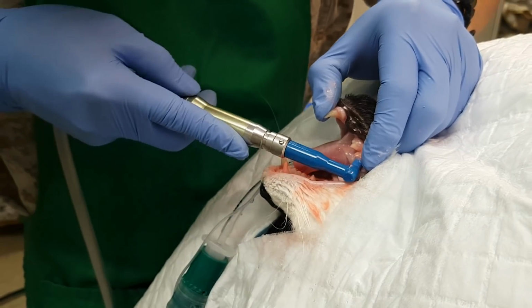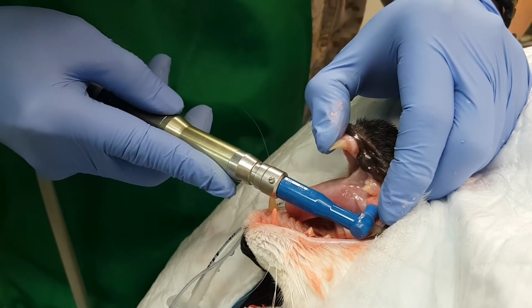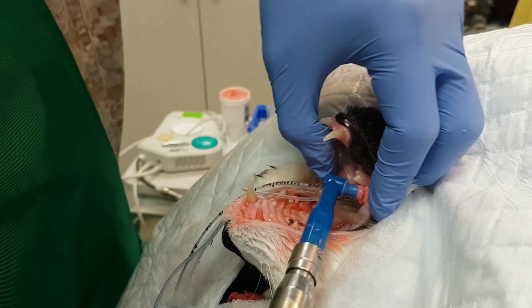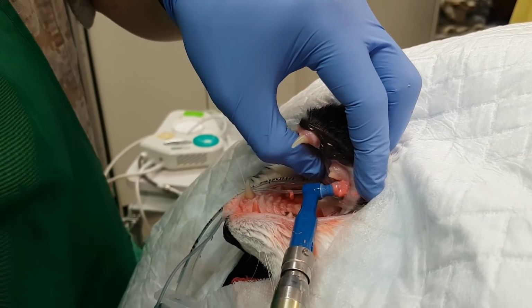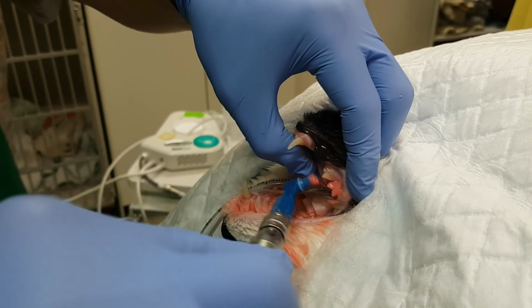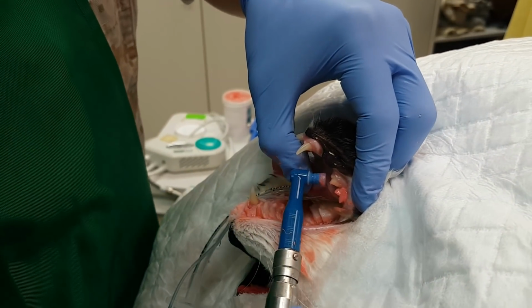And here Mr. NJ is polishing the teeth. So after we're done scaling, getting the biofilm and the plaque off the tooth, we need to polish it to buff out all the microscopic scratches we put into the tooth, as well as to remove last vestiges of any adhering material. And again, no way you can ever do this without an anesthetic. Making sure those teeth are as clean as they can be, getting right down to the gum line.